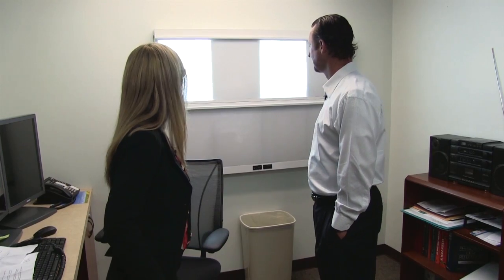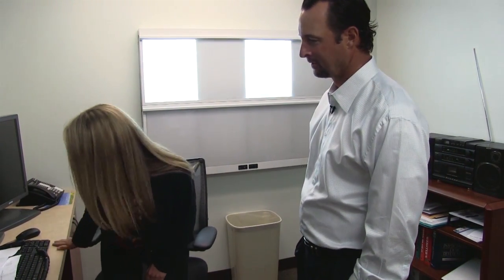Tim, this is Dr. Sanchez. Hi, Dr. Sanchez. Hi, Tim. Nice to meet you. Let me show you what we do as radiologists. Awesome. As you can see, these light boxes are basically just here for looks now. All of our images come through the computer, and we're able to visualize them and look at them on these high-resolution monitors. That's awesome. They're sent over immediately after the patient gets off the table, and also within an hour of the patient getting off the table, our referring physicians can also look at the patient's images prior to the patient coming for their exam. So it is something that they like to have that access and that feature, yes.